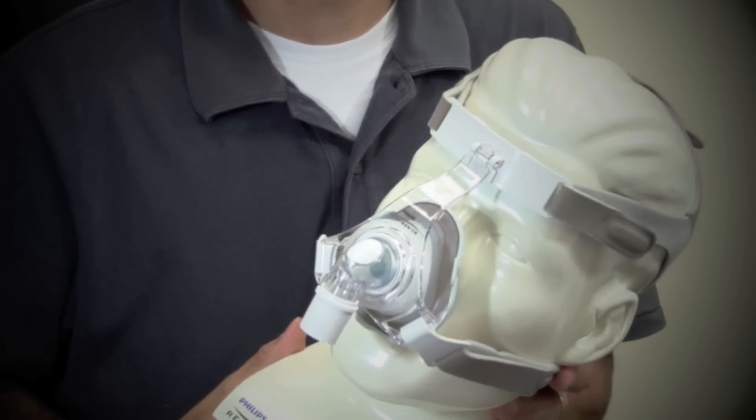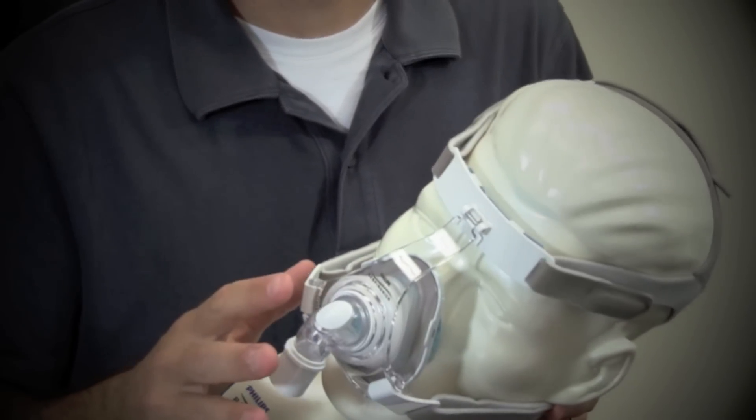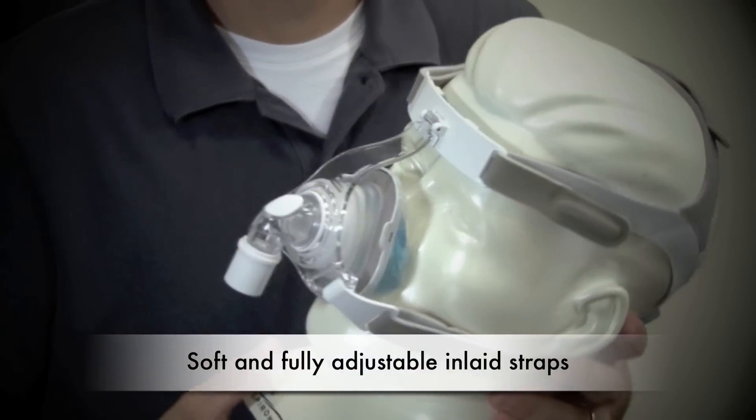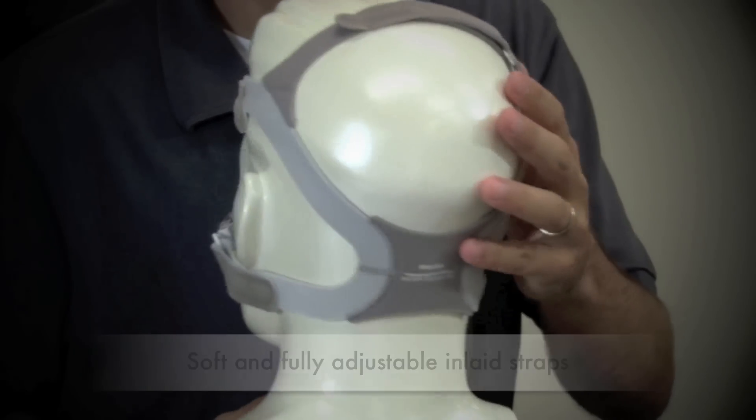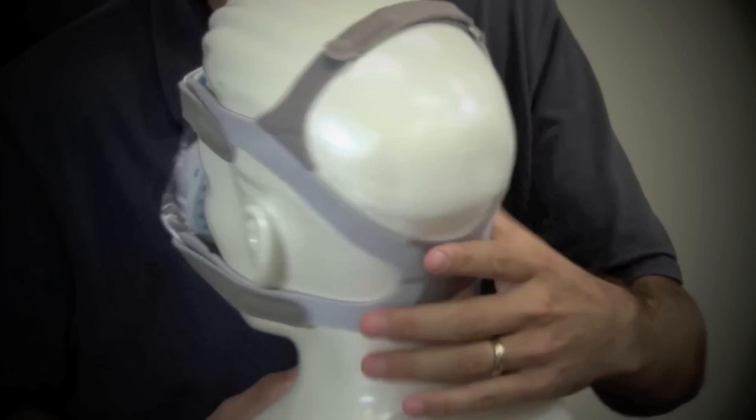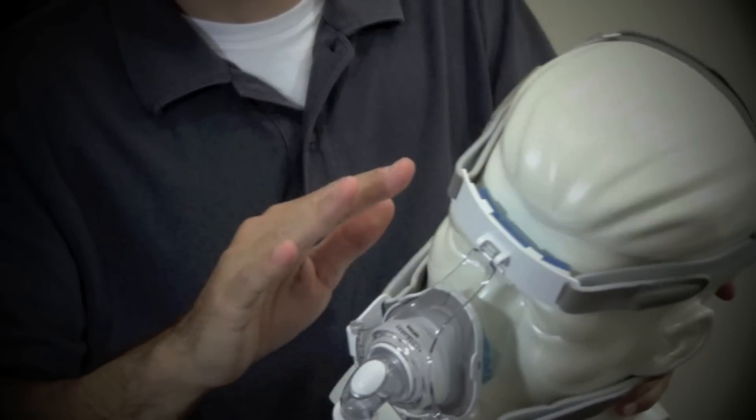The True Blue Gel Nasal Mask is designed to deliver a high degree of comfort, stability, and freedom of movement. Here's the headgear. It has adjustable straps that meet into a single back panel with a crown strap for added stability. This is all completely adjustable.